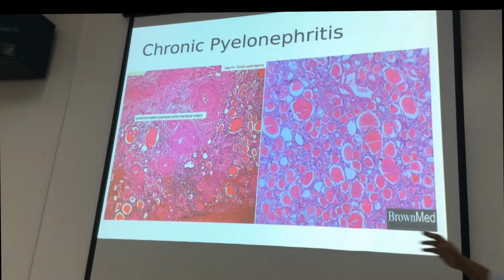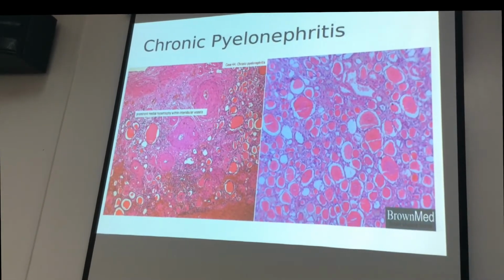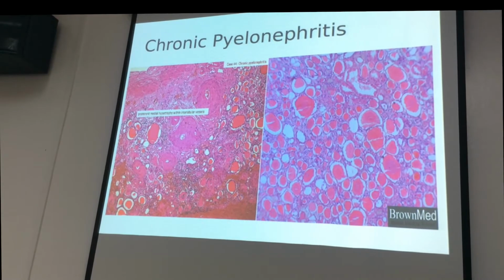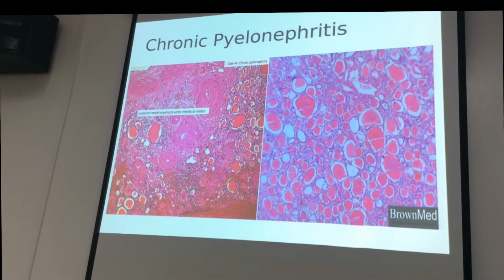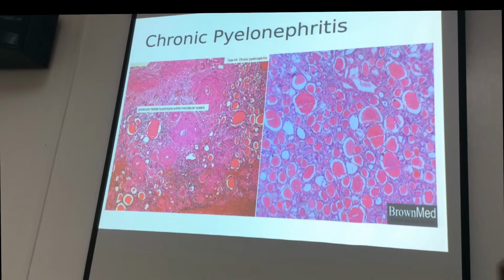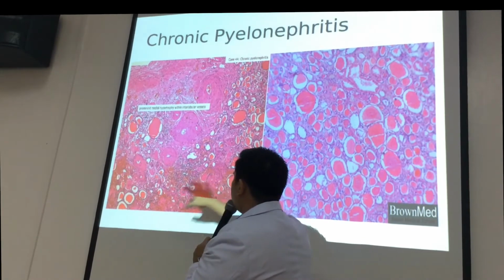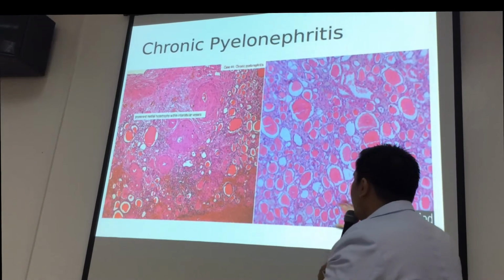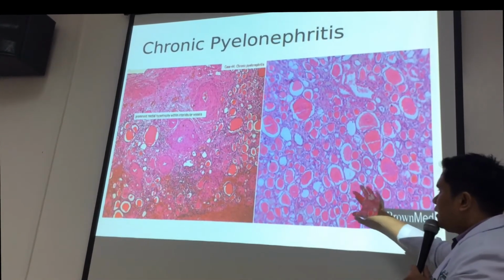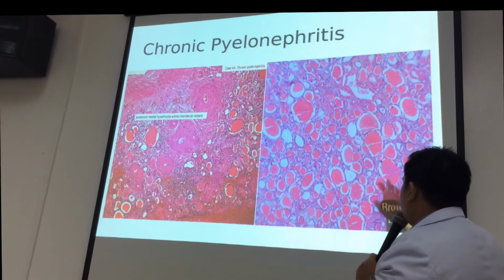Now, these injured renal tubular cells will secrete this proteinaceous, homogeneous pink material, which will make the kidney appear like it's a section from the thyroid. So this is now called the thyroidization of the kidneys. Another part, these are your supposedly longitudinal renal tubules. Because of massive fibrosis, they will contract.